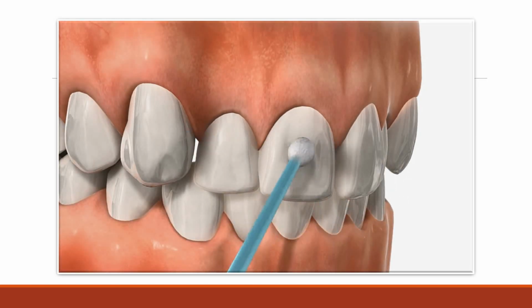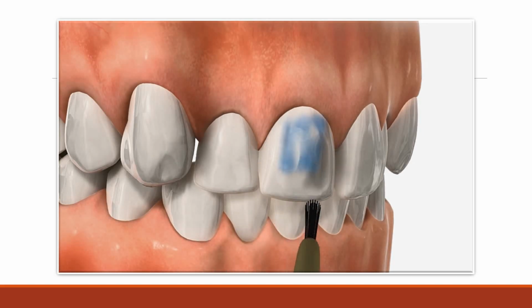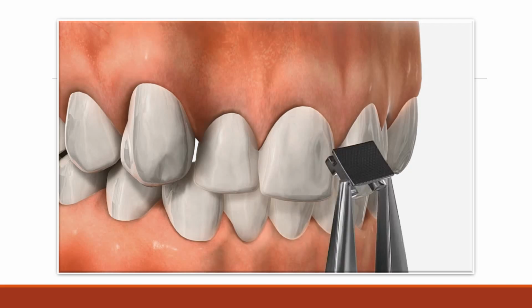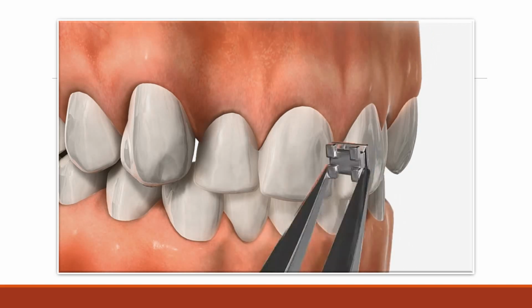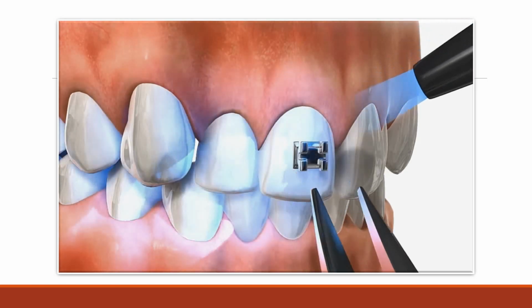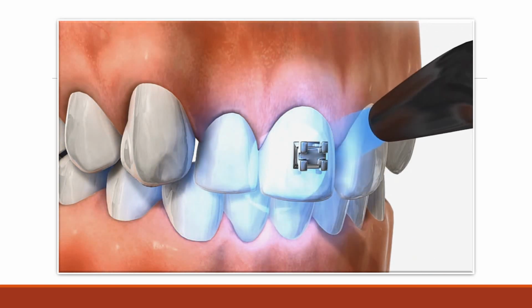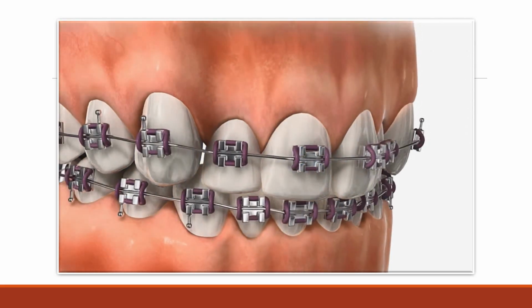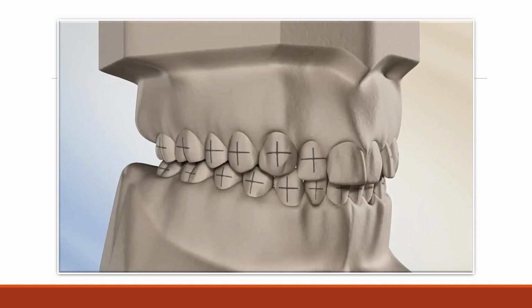It is very important to clean up excess composite or flash, because it can create problems in maintaining high levels of oral hygiene and result in demineralization around the bracket, a major risk of fixed appliance therapy.